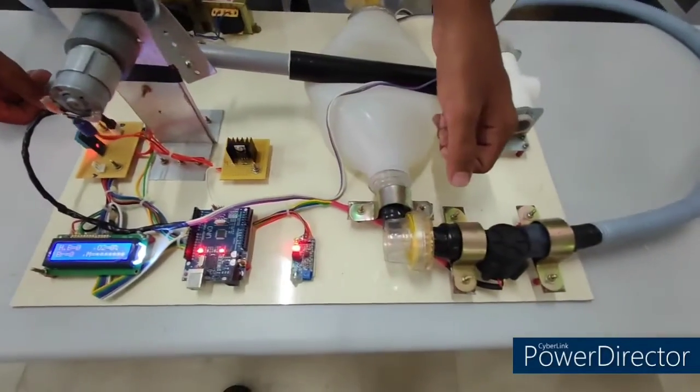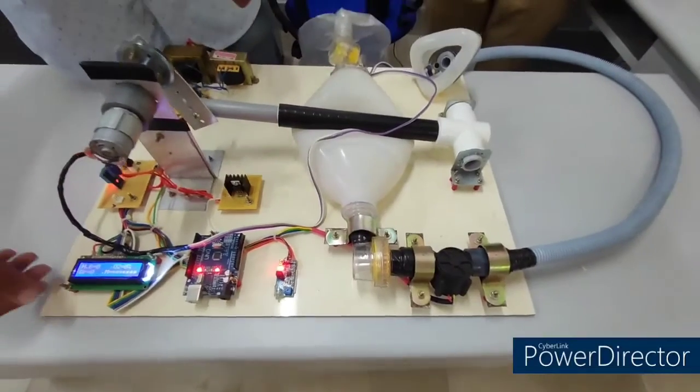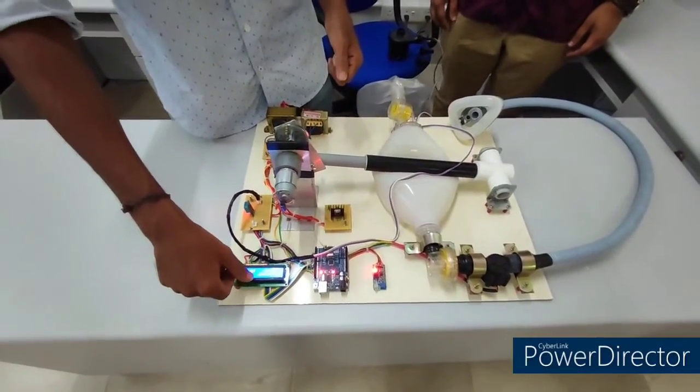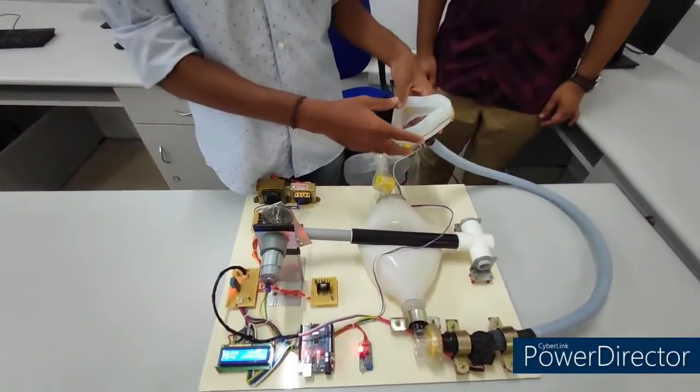The oxygen percentage is obtained from the airflow sensor placed at the output of the Ambu bag. We can also read the breath rate using the pressure sensor in the mask.